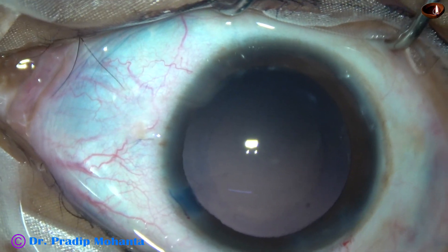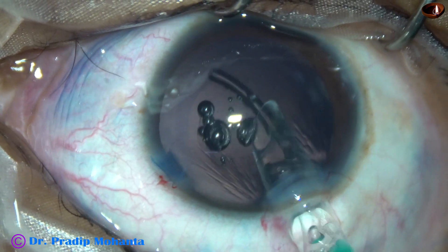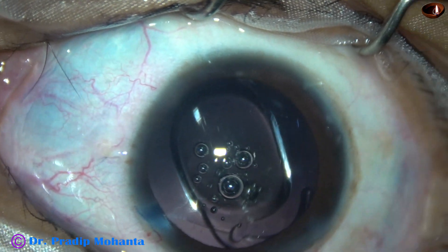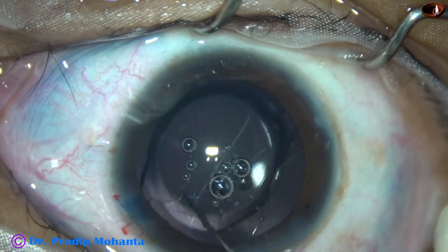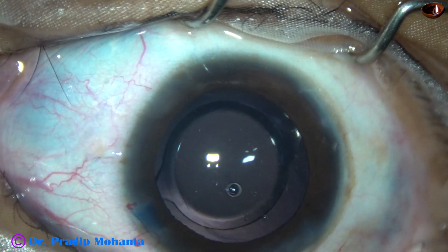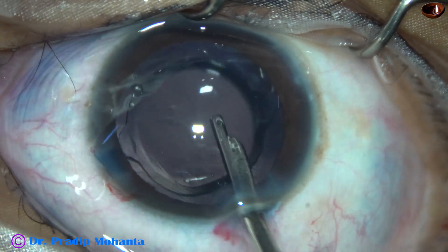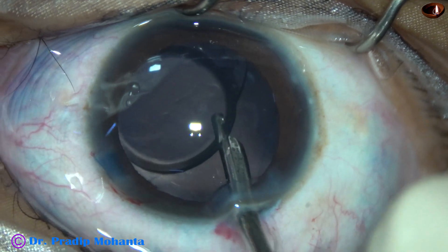Viscoelastic is used to fill up the capsular bag and the anterior chamber. This is Tecnis 1 from Johnson & Johnson — no financial interest, but this is my favorite monofocal intraocular lens. Beautiful lens, no glistening over the years, and patients are very happy. It's an aspheric lens. The size of the rhexis has been about 5.5 mm and the optic is getting overlapped by the rim of the anterior capsule all around.